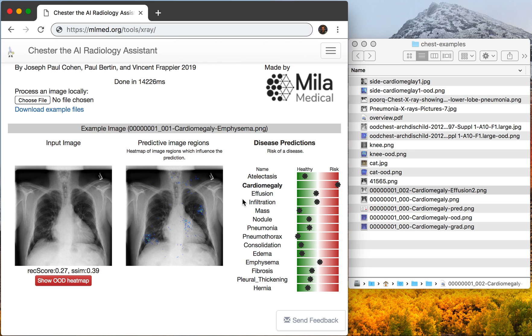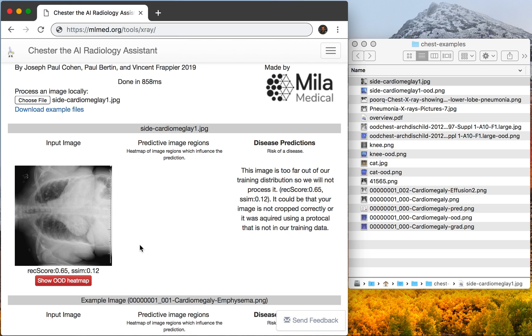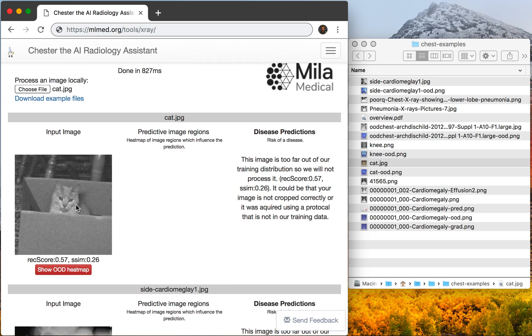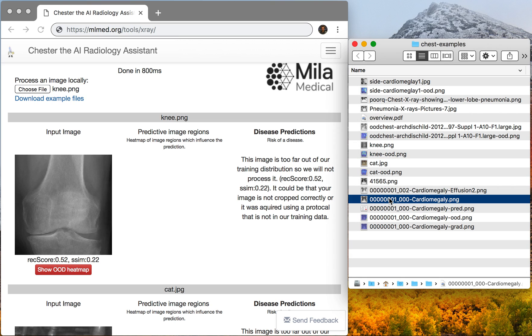An important attribute of this system is that it focuses on only predicting x-rays that have been validated to be in the training distribution used to build the system. So if there's an x-ray that's not correctly oriented, the system will not process it. Or if there's an image that has nothing to do with x-rays, it will also not process that. Importantly, for x-rays that don't exist in the distribution the model was trained on — such as one processed by an x-ray machine with unusual image properties — instead of giving an erroneous prediction, we will fail to predict it entirely and the system will not give an answer.